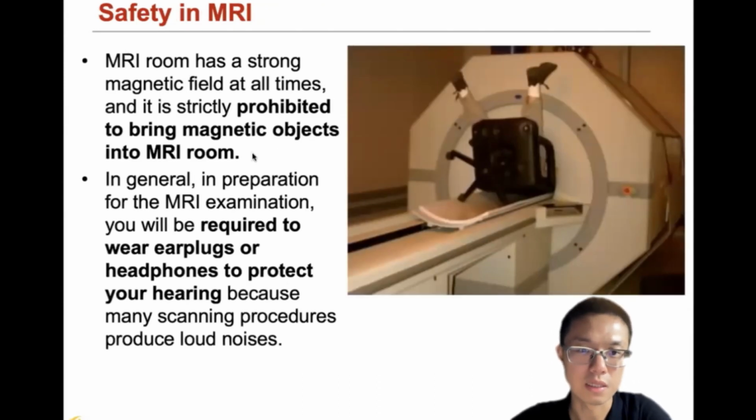And also there are some safety protocols in the MRI operation room. The MRI room has a strong magnetic field at all times, because the machine is always on, and it's strictly prohibited to bring magnetic objects into the MRI room, as this will interfere with the magnetic field.